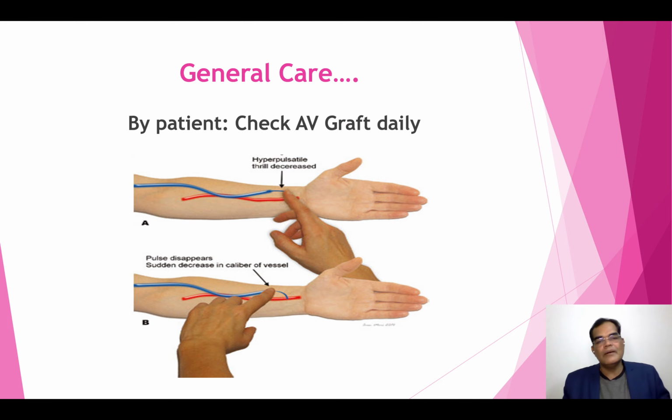Another basic care is that the patient needs to check the AV graft every day, whether there is a thrill or bruit over there. This can be done by the patient at home every day, just like a small ritual.